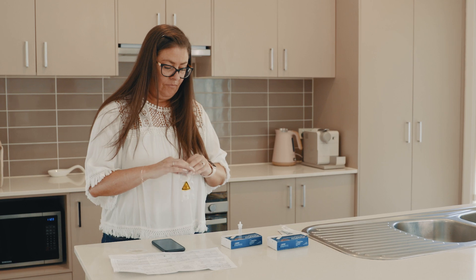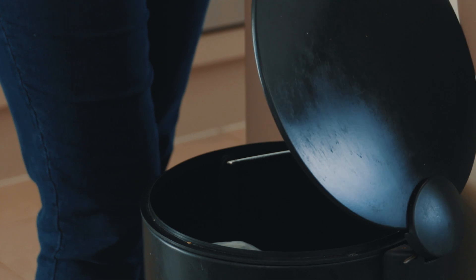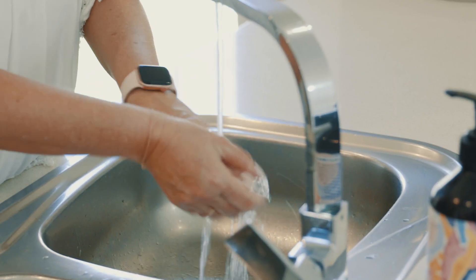After completing the test, place all used test kit components in the waste bag provided and place this in your general waste bin. Wash your hands thoroughly after disposal.